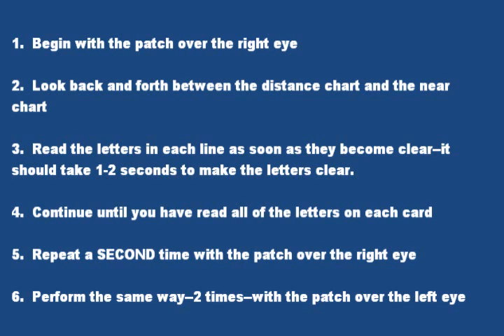One, begin with the patch over the right eye. 2, go back and forth between the distance chart and the near chart. 3, read the letters in each line as soon as they become clear. It should take 1 to 2 seconds to make the letters clear.